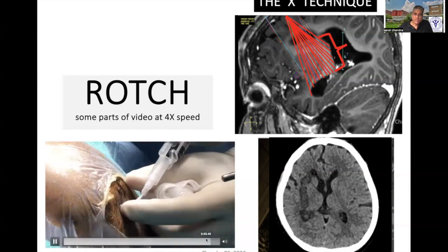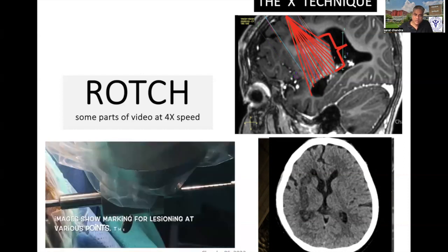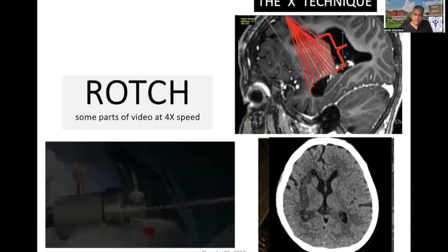When we withdraw, we inject glue. So you can see there is not a loss of a single drop of blood. For the sake of modesty, we said that the patient loses less than 5 cc of blood, but truly speaking, there is no loss of blood at all.